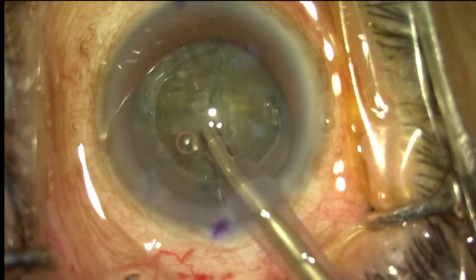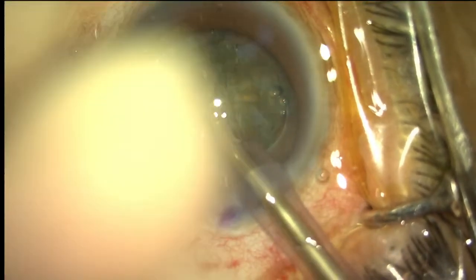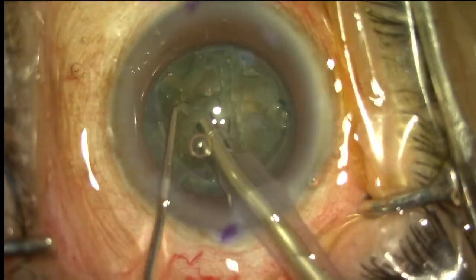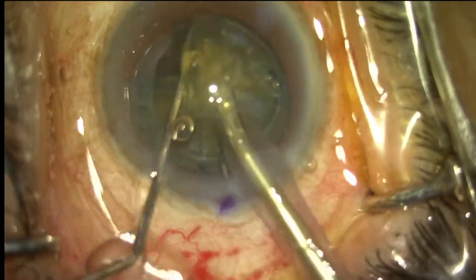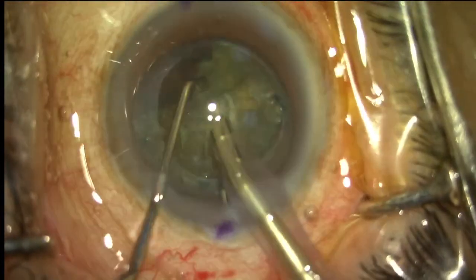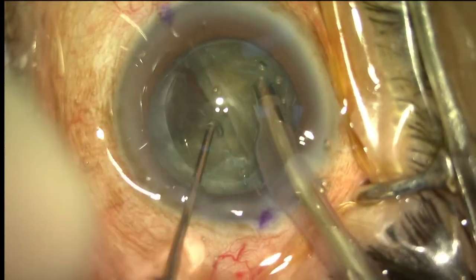Now I'll move to the quadrant. Please switch to the quadrant parameters. Softening has already been done by femto, so very little energy is used.